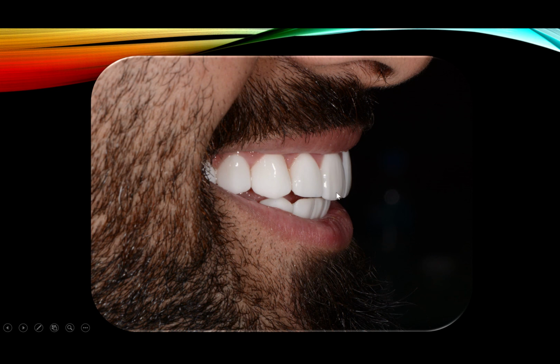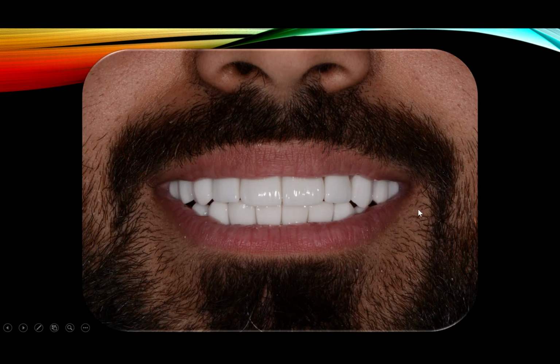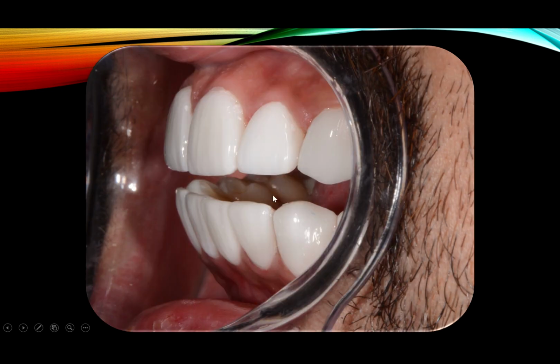Even the textures, most of the textures or some of the textures are obtained in wax, the rest are obtained by carving and then just double glaze and cement. It's pretty thin, but I can't show you how thin it is. I don't think I took a photo of how thin these veneers are. This dentist does the overlap thing. She likes the overlap, but over here, you can tell that it's a thin shell. Even the overlap is really thin.